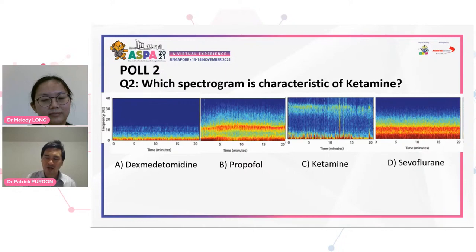And to that point, responding to another question about how these numbers have been constructed in children, it's really not clear how the numbers in general have been constructed. We know they're based on essentially these same waveform and spectrum features that we're seeing here. They're basically processing those and projecting them onto some number. So we know it's based on these fundamentals that we're trying to go through. How that gets reinterpreted for children is a question. We just don't know that. That's a proprietary secret. And I think that does motivate our need to understand more about the fundamentals.